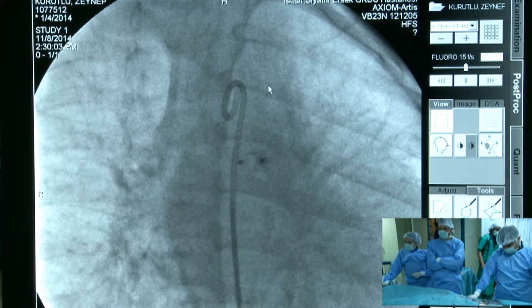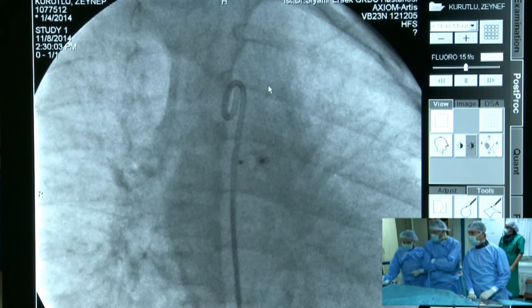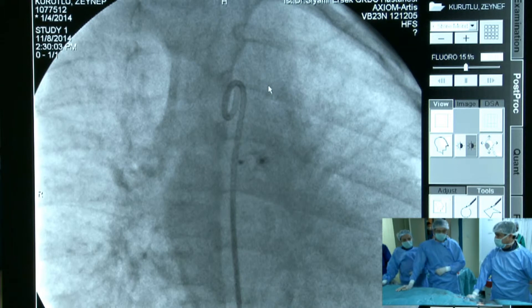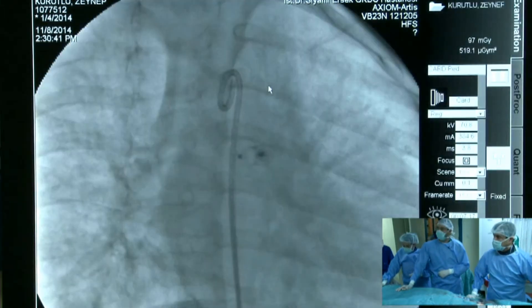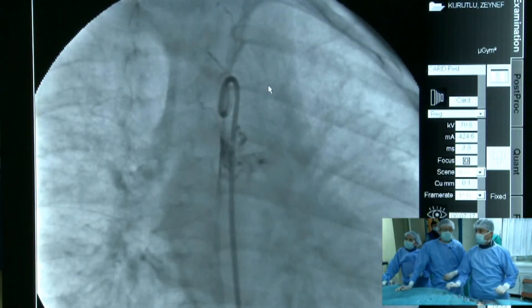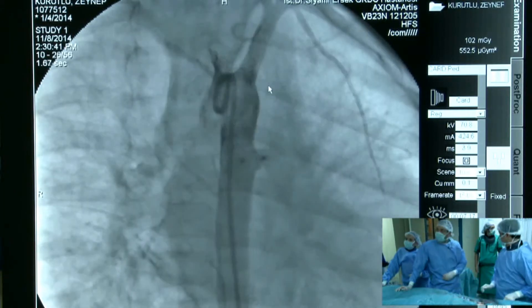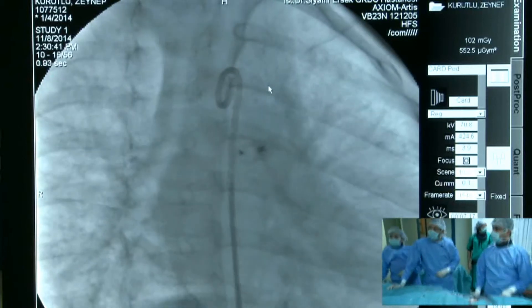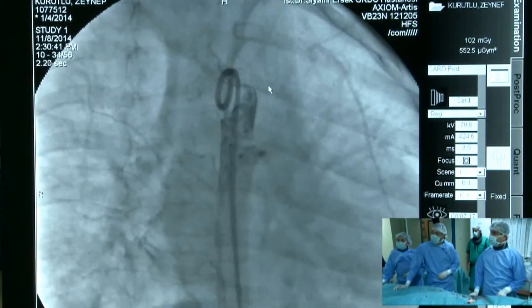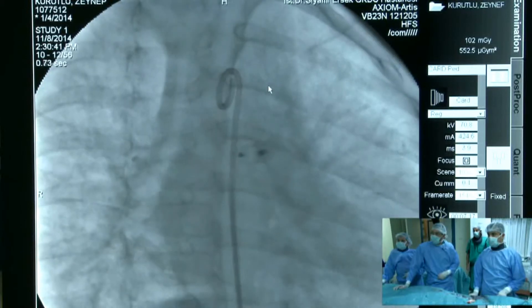I share the concern, but on the other hand it looks stable. You would not want to go with anything bigger at this stage, and I think it is absolutely fine. If it does embolize, it would go into the aorta — in that case, retrieve it from the venous side, not the arterial side, in a small baby. I agree with Joe. There is the same concern, but it looks like complete occlusion — they have got a good result.